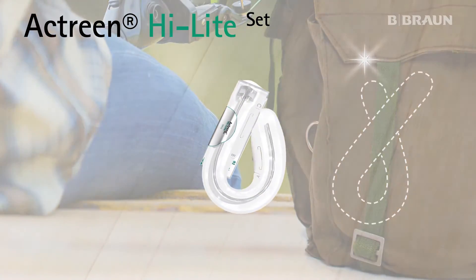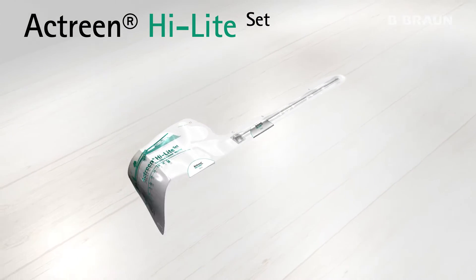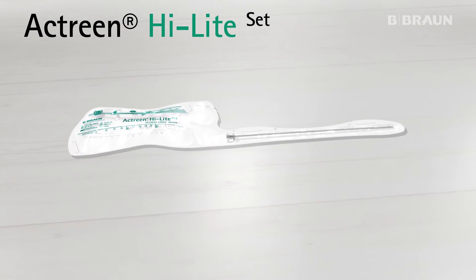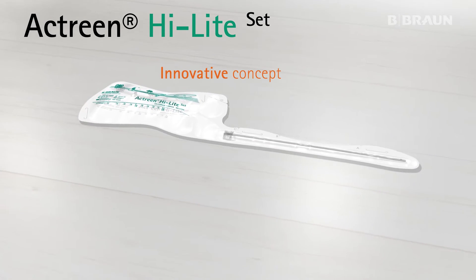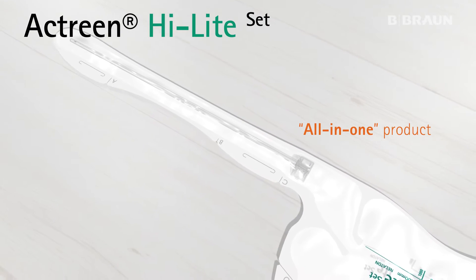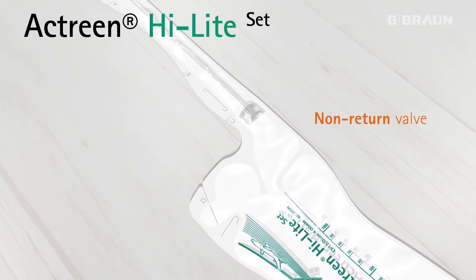Actreen Highlight Set is the latest member of the Actreen Highlight range, specifically designed for self-urinary catheterization. Thanks to its innovative concept, the Highlight Set is an all-in-one product, including a catheter sealed to a collecting bag and equipped with a non-return valve.